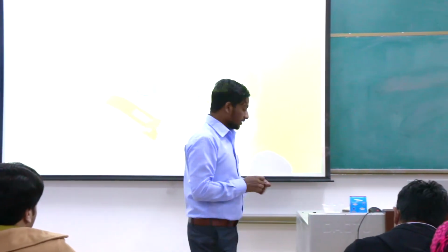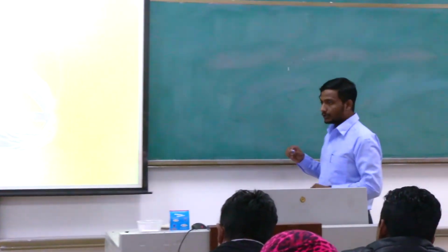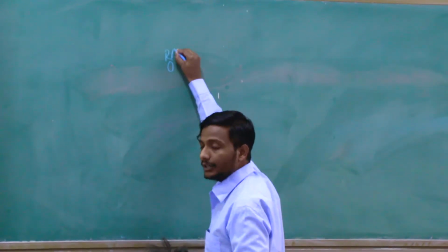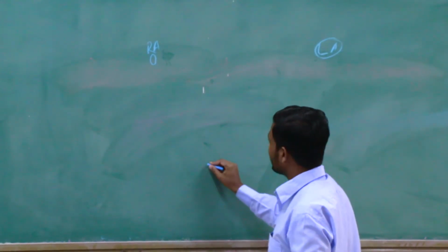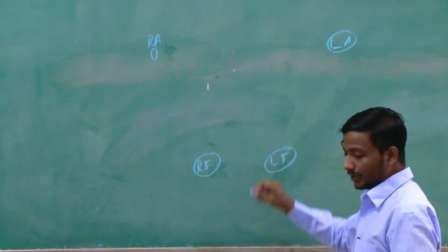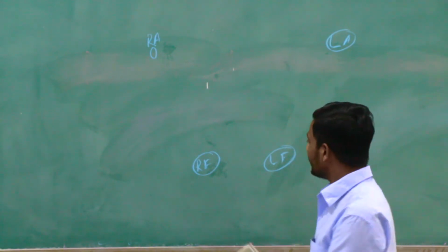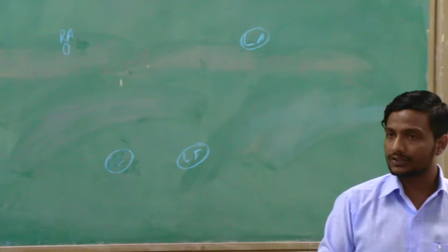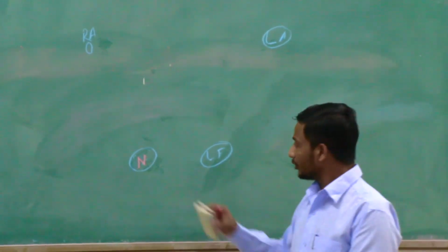Right? Okay, so now let's see. If I am talking about the 4 limb electrodes, you tell me: in the right arm we use the right arm electrode, in the left arm the left arm electrode, and there is the right foot electrode and the left foot electrode. Out of these 4, which one is the neutral one? The right foot. What is the use of this right foot electrode? Augment the current. This is a very, very important function. So I am going to change it to neutral, and we are not going to use it for recording.